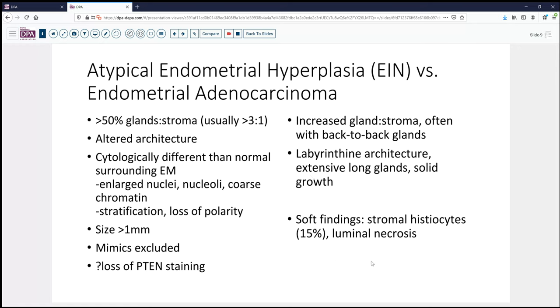There are additional findings that can sometimes be helpful. Finding stromal foamy histiocytes in the stroma — found in about 15% of cases — is a greater marker for carcinoma than hyperplasia. Finding areas of luminal necrosis also bodes more likely for carcinoma than hyperplasia, though not found in every case. What we do not call solid growth, however, is squamous metaplasia. Let me take you through a couple of cases and illustrate how I try to apply these sorts of criteria.